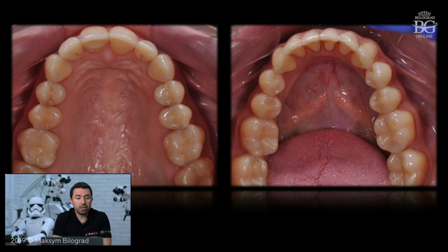So in this case, you can see her arches are narrowed, and her lower teeth and upper molar teeth are almost intact. The ideal way in this case to provide aesthetic and minimally invasive treatment is to do orthodontics. By orthodontic treatment, we may make pretty wide arches, and then you can place veneers and everything you want, and everything will be perfect.